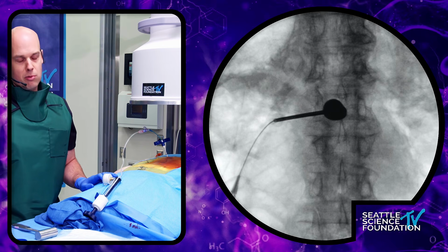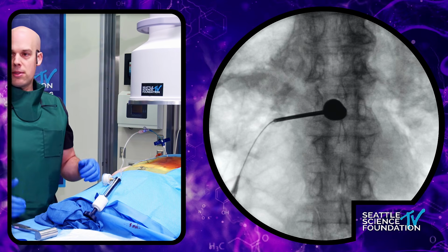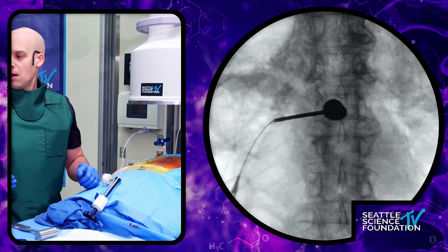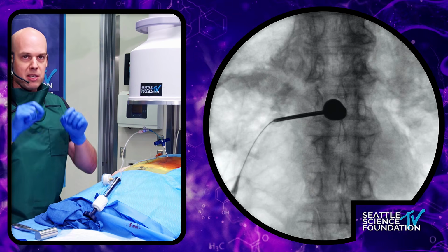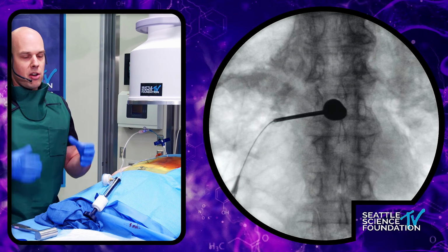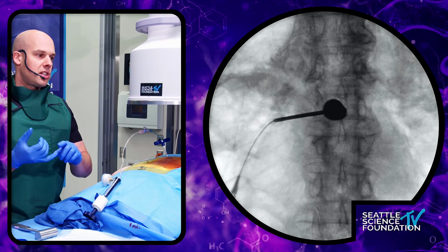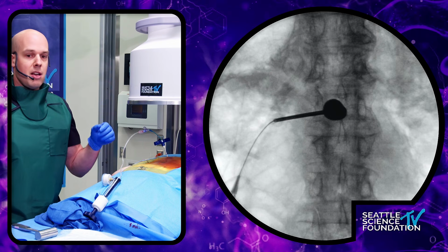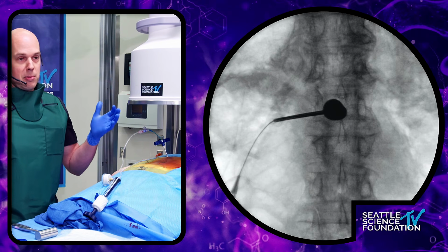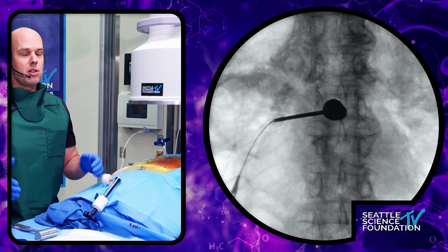Basically, rather than having a very homogeneous barium sulfate mixed with the PMMA, you're going to have some tracking beads that contain the barium and the contrast. So it is much easier to see the flow within the vertebral body, if you're within a lumbar vein, or whenever you have a little bit of extravasation within the paraspinal soft tissues.